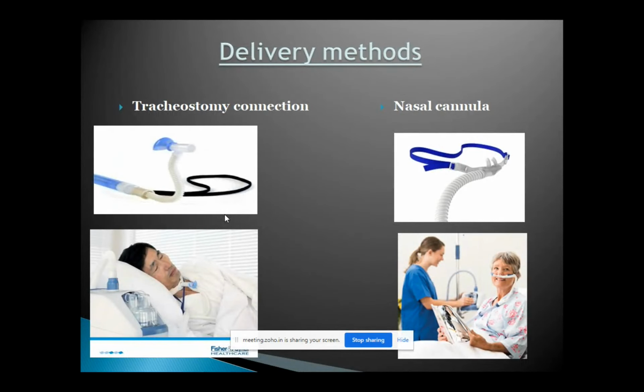So with this device, it's not one particular set of devices available, not only nasal cannula. If your patient has a tracheostomy, this is one of the best ways, because imagine if your patient has a tracheostomy, you have completely taken away their natural humidification process, because humidification happens in your nasal cavity. With the tracheostomy, you've taken the process away. So that means if you give dry oxygen to your tracheostomy patients, they are likely to block their tracheostomy tube with a mucus plug.